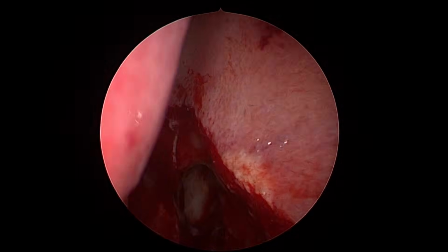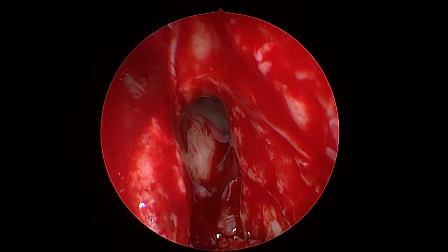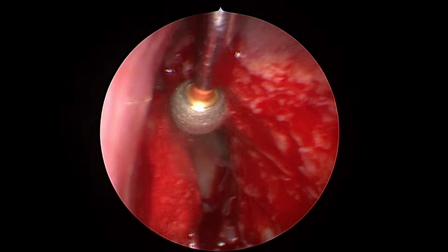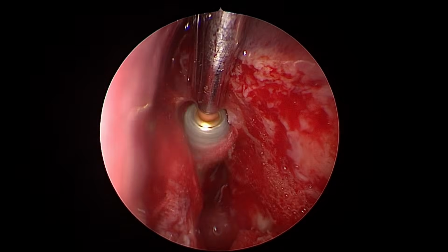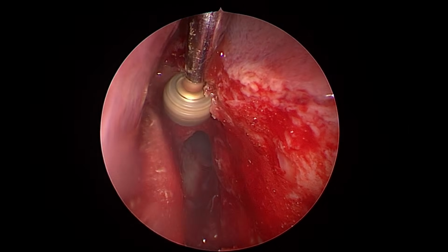Now, see this overhanging beak I have done. See now, you can push your topicals more effectively. If still you are not happy, yes, see this. In minutes' time, the idea is my patient should be able to deliver steroid effectively.